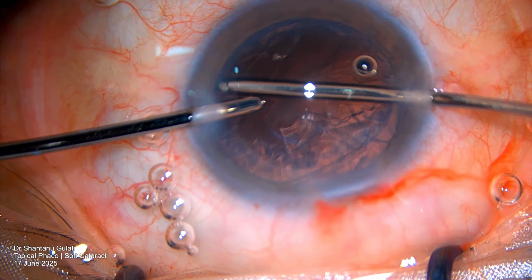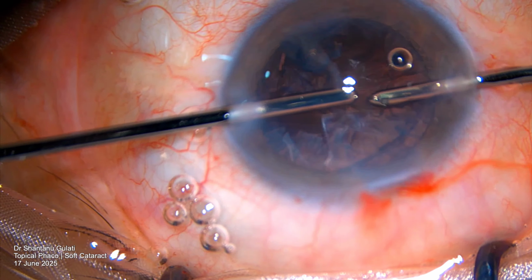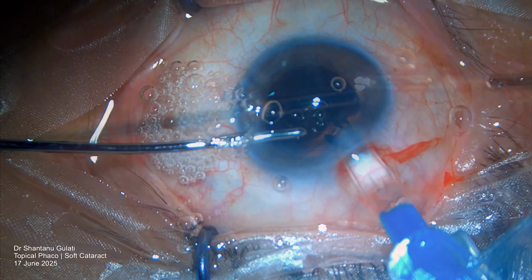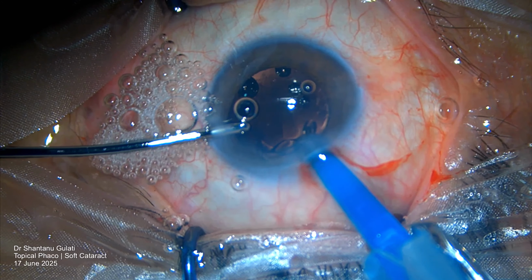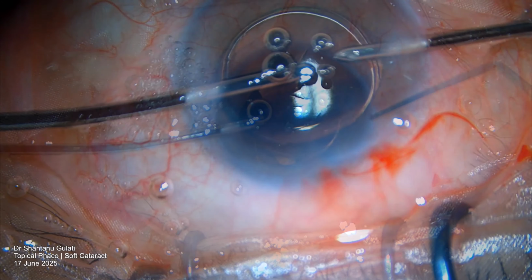So the point I'm trying to make is that even as beginner surgeons, we should try and explore our machines, and the decisions we make, the settings we choose, should come from a deep understanding of phaco-dynamics. Running the machine on low settings under the guise of safety is a mindset we need to move on from, and the sooner we do that, the better surgeons we become.